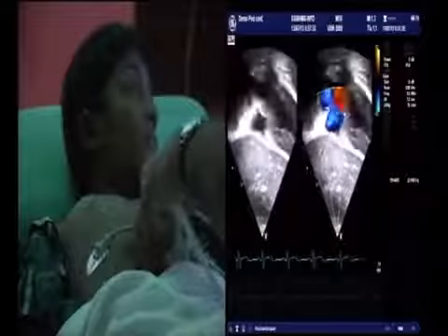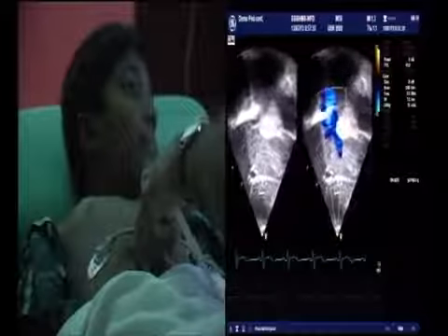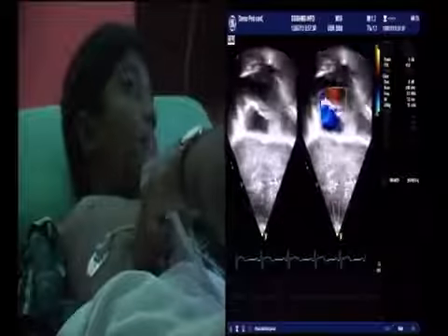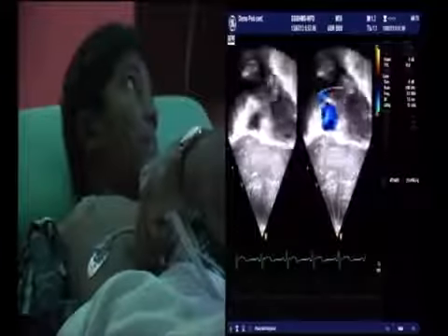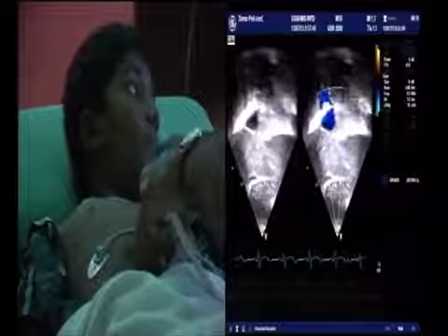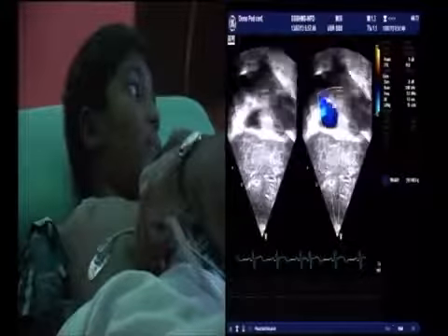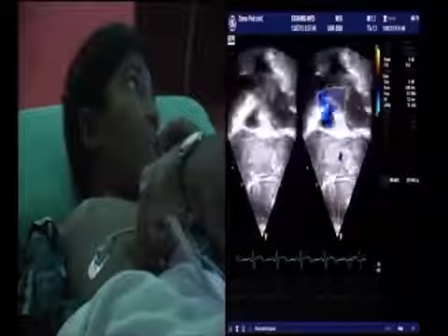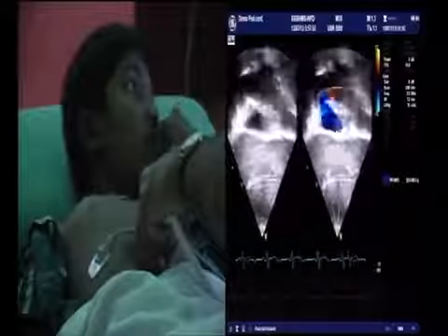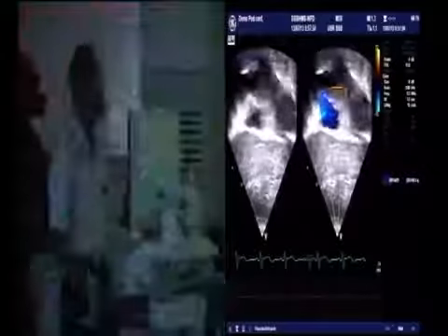I can see both the hepatic veins opening. Can you see that? Now slowly look for the junction here, the atrioventricular structure that opens there. You can see here is the coronary sinus. Normally it is small, so you will see only a red color flipping into the right atrium there because flow towards the transducer is red. And now you can see both the coronary sinus as well as the intraatrial septum.